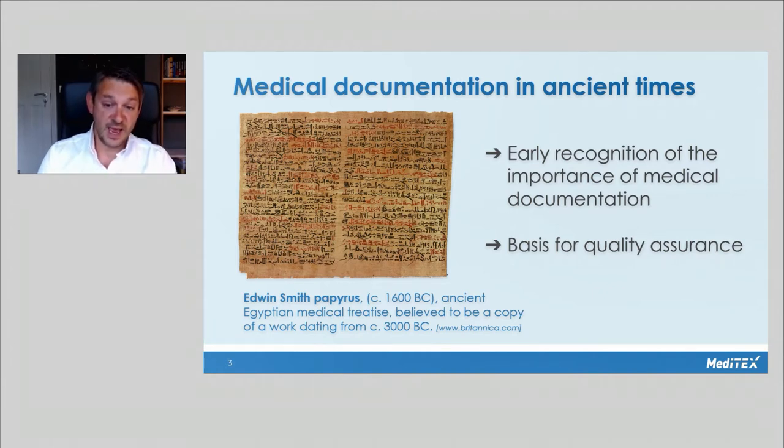Case documentation today is considered critical for several reasons, including sharing medical knowledge, innovation, breakthroughs, and observations with others in the field, protecting the well-being of the patient, and of course, to minimize the risk of potential harm to the patient, and also to protect the medical team from any medico-legal cases. In the course of time, patient-related documentation changed from a monological text corpus to a collection of structured documents. The medical history has become a patient file or record.